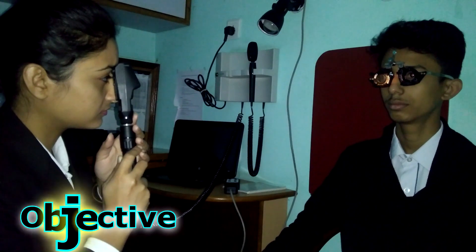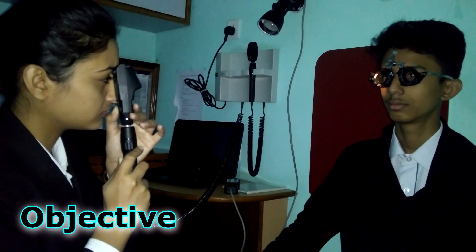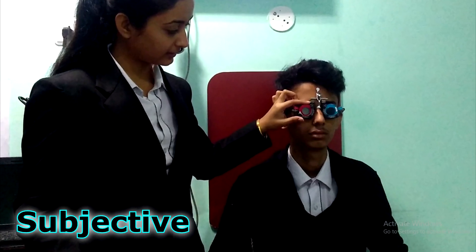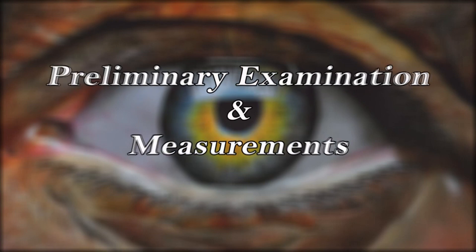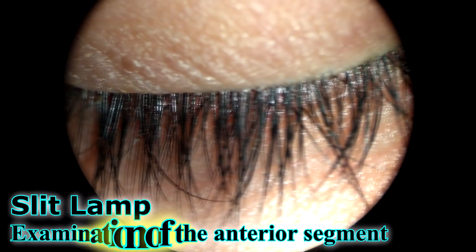To determine the power required by the patient, we have to do both objective and subjective refraction. In objective refraction we are using a retinoscope, and in subjective refraction we are using a Snellen chart for distance and a reduced near insert for near.